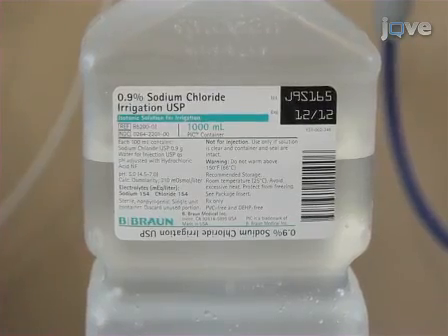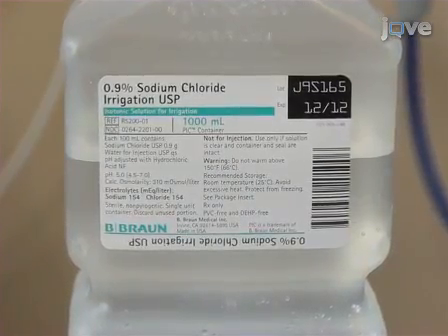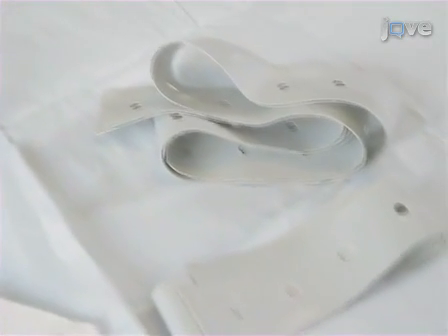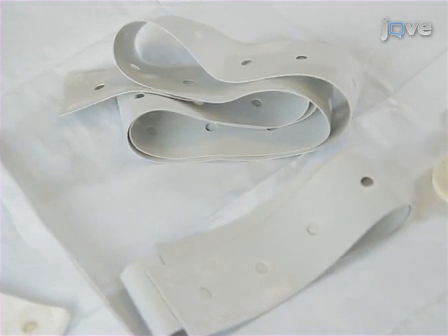Sodium chloride solution in the concentration range of 15 to 140 millimole is also recommended to assure patient comfort while minimizing stimulation voltages. A tape measure will be needed to locate stimulus locations and elastic or rubber head straps to position the electrodes. It is important to assure that the straps are made with non-conductive material so that they do not increase conductive area if they get wet.